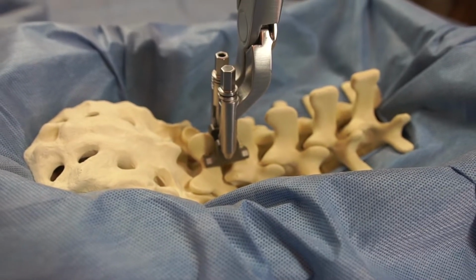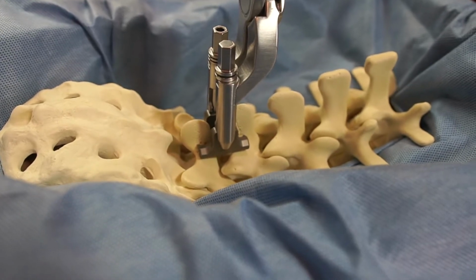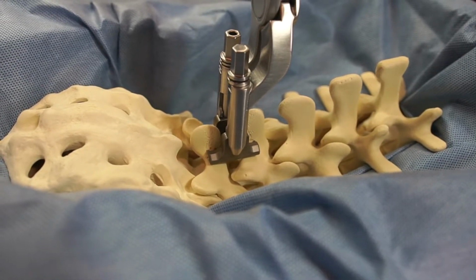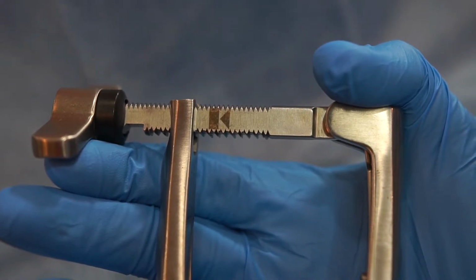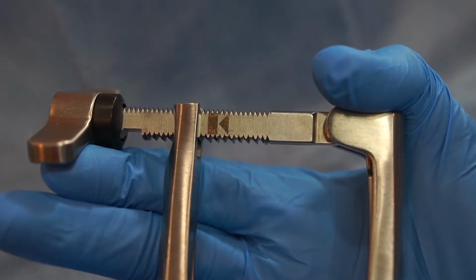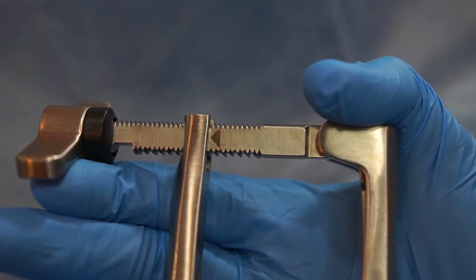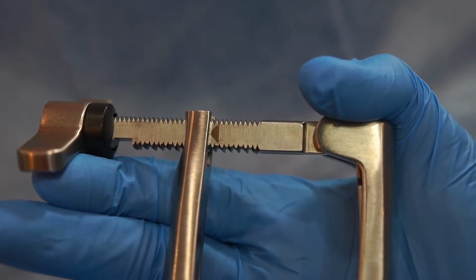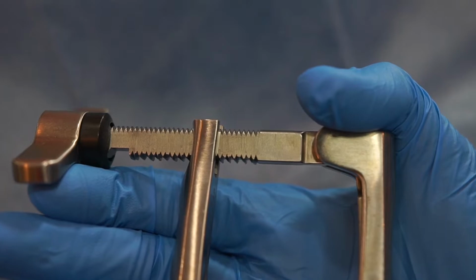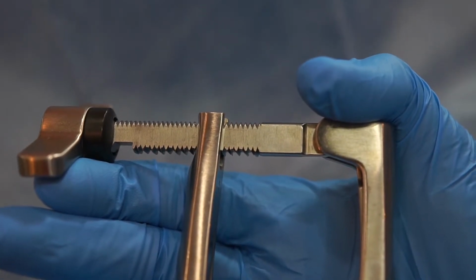Visually confirm that the implant spikes are fully seated in the bone, with proper apposition against the spinous process or lamina. To ensure that the set screw is located over the tray for locking, at a minimum, compress the handle until it at least covers the black square for the regular 23mm tray, and at least covers the black triangle for the short 18mm tray on the threaded ratchet arm.